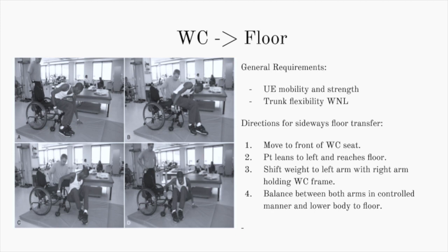Prior to transfers for patients with paraplegia, they will be evaluated by the physical therapist to determine their current level of function and goals. These patients will generally maintain upper extremity range of motion and strength and will use a manual upright wheelchair. However, a patient who has more difficulties may use a push rim assisted power assist wheelchair. It combines the benefits of a manual and power wheelchair, designed for patients who have some upper extremity weakness, joint degeneration, difficulty propelling manually, or decreased exercise capacity and/or endurance.